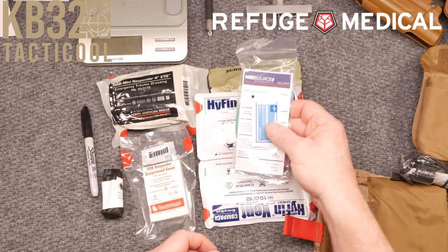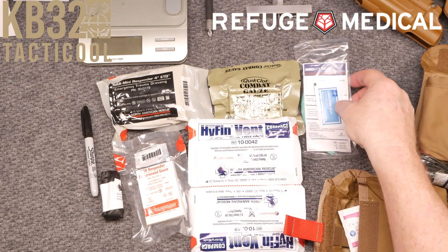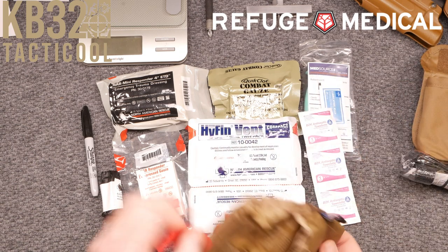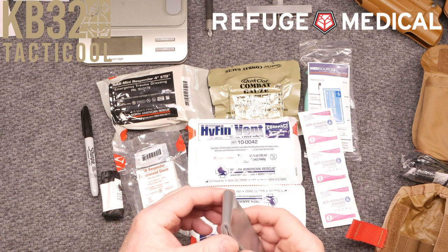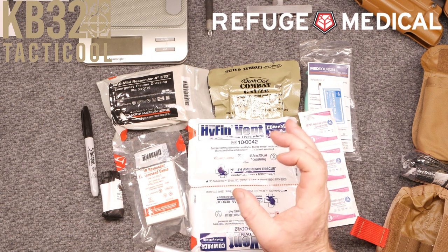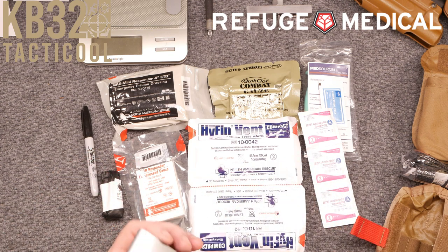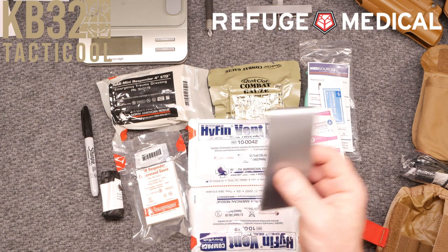You always use lubricant with the nasal airway — don't forget how important it is to make sure everything is lubricated before you insert it. We've also got some antiseptic towelettes. This is a trauma kit, not a first aid kit. And we've got some duct tape — I actually carry a small roll in other IFAKs I put together. If you don't have it, take some gorilla tape — the black stuff — it is absolutely incredible.